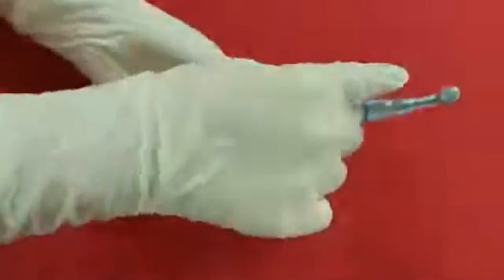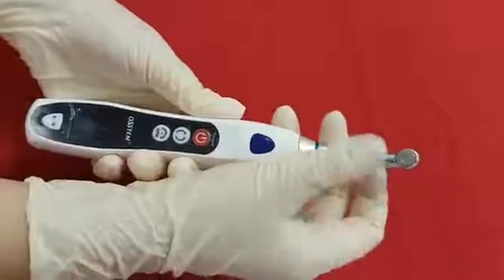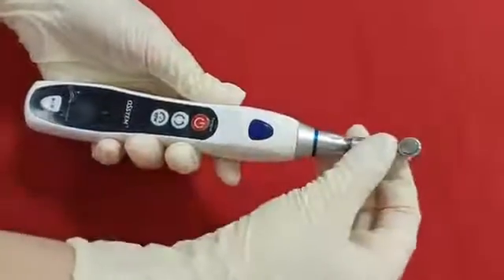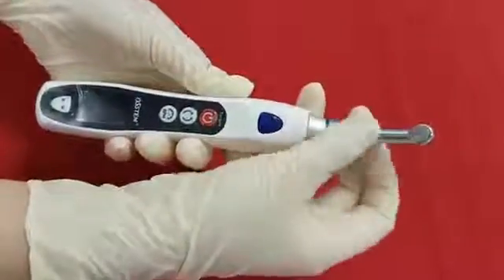On the top, there is control angle head and it is easily separated by opening the neck part counterclockwise for disinfection. You can use the autoclave for 15 minutes only for this head part.